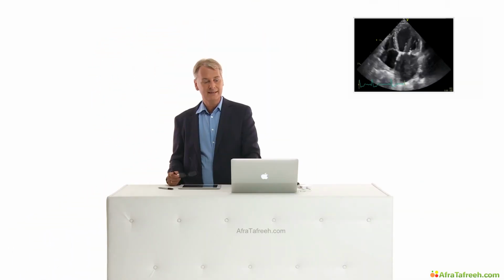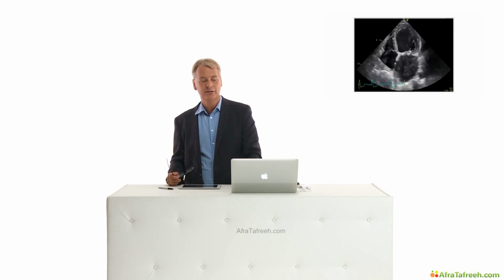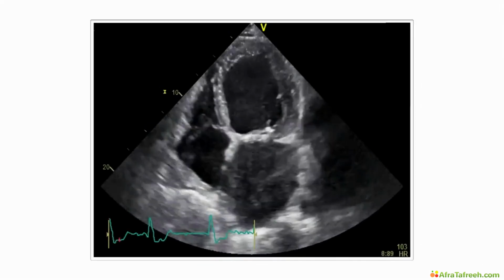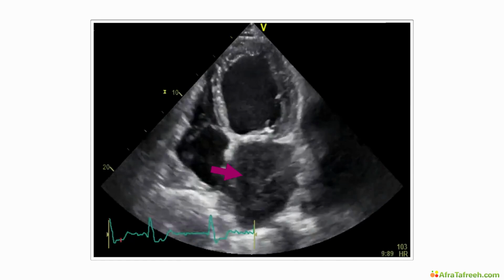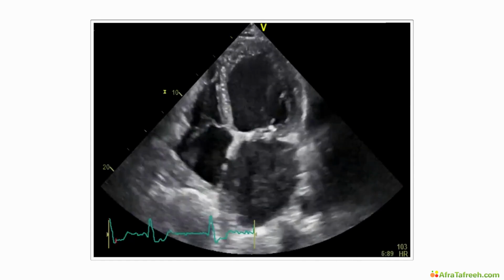And this is very nicely exemplified in this echo here. This is a beautiful example where you have many of the factors that I talked about in one image. It's a patient who received a mitral annuloplasty where the ring was relatively small, and therefore there's some degree of obstruction. Now, this leads to slow flow in the left atrium, and this spontaneous contrast that you see right here is more or less a predisposing factor for thrombus formation.